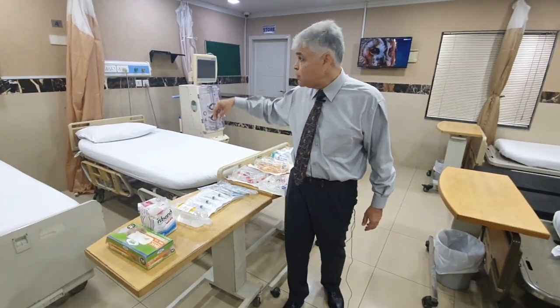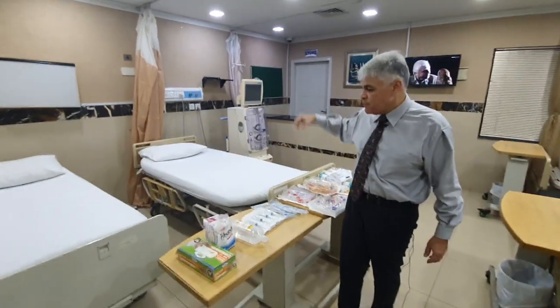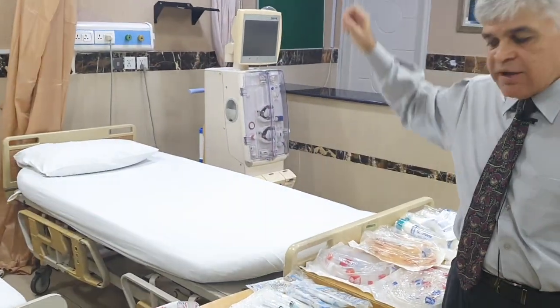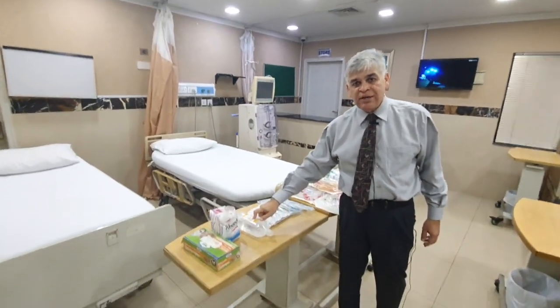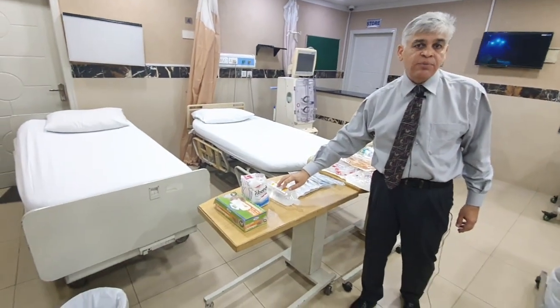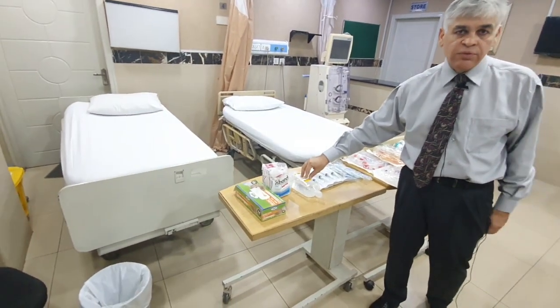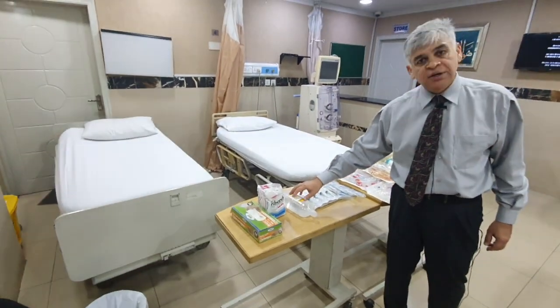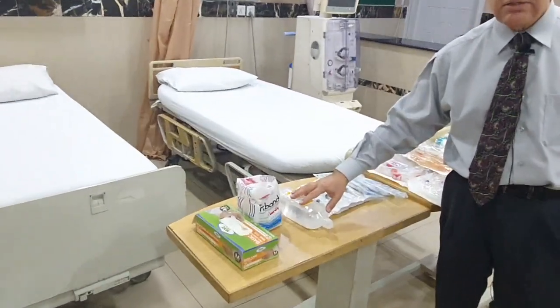But the important thing about saline is that when you use saline as a priming fluid, we tend to hang it up as well, which you'll see here in a minute, on the dialysis machine, those IV hangers. If the patient becomes hypotensive during dialysis, this is the fluid which will immediately bring the blood pressure up, and that's why we use normal saline in place of all the other ones, because they will not help if somebody becomes quickly hypotensive.